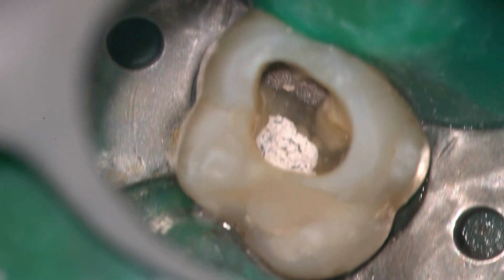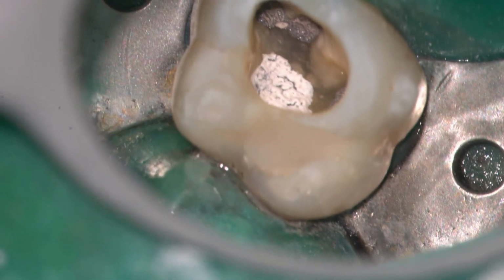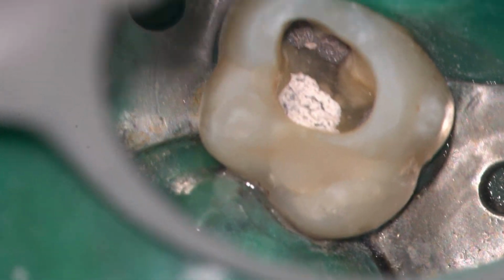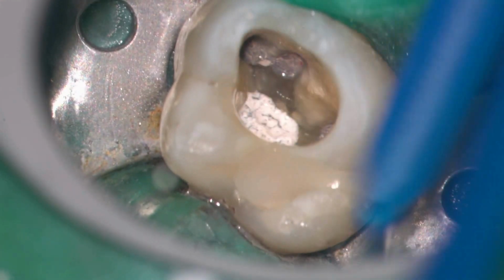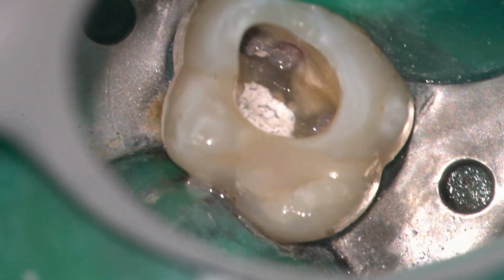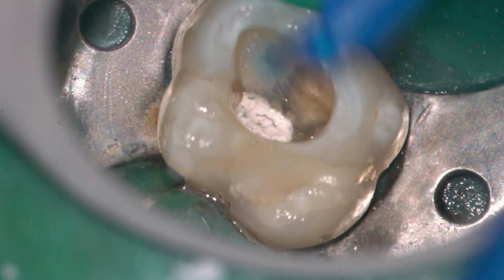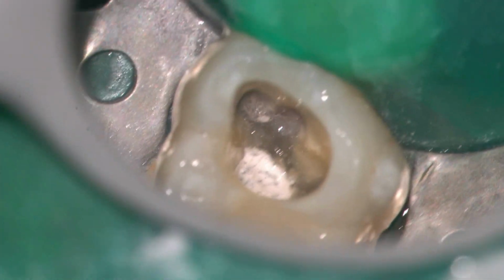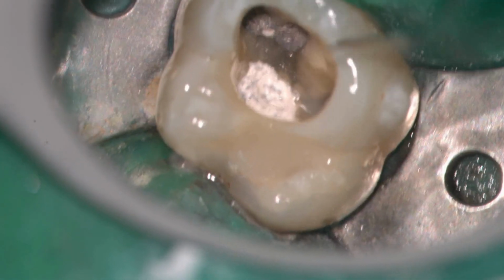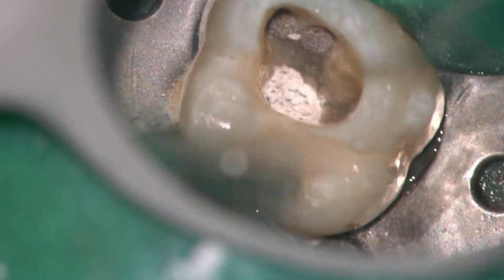Here I'm inspecting the access prep. It's clean of all debris on the walls. The dentin looks nice and frosty, like it's fully etched. And I go ahead and place the primer, 5 coats. In this case I'm using Photobond. Occasionally I use OptiBond FL if the prep is not that deep. And then place LuxaCore as a macrofill composite material.